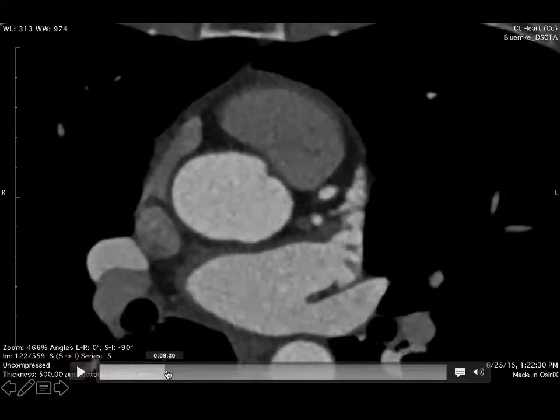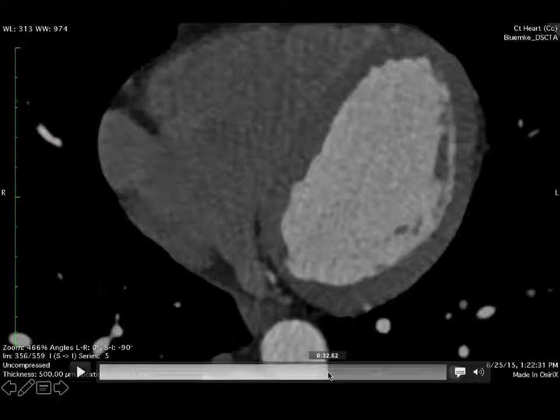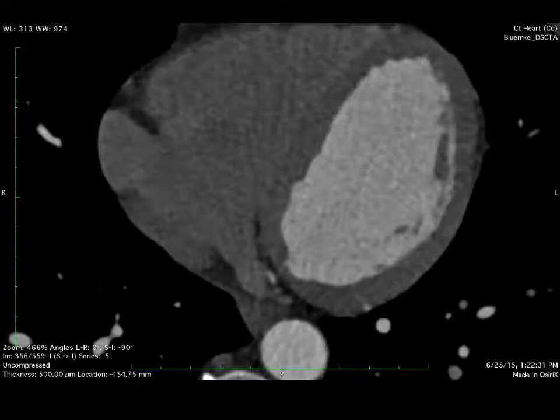They go like this. They page through and look at all the vessels, and they have to make the call, right? And they say there's a critical stenosis in the RCA. And if they get that right, then they can answer the question for points. The people who are really good at this, they do that time and time again in about 3 seconds. They just go whoop, once through it, and they pick up all that stuff.